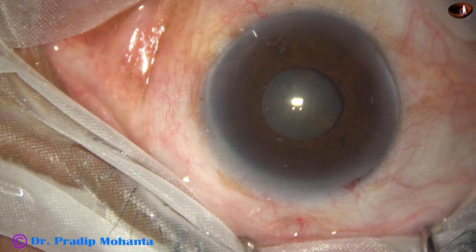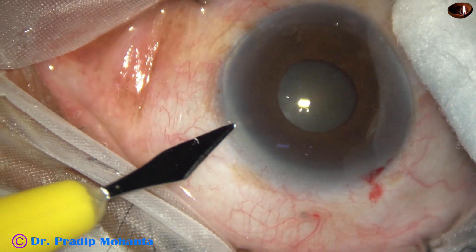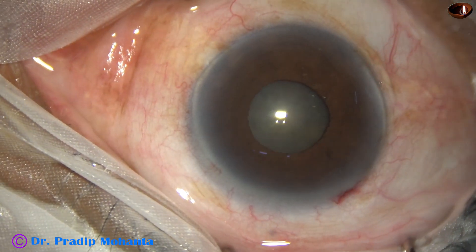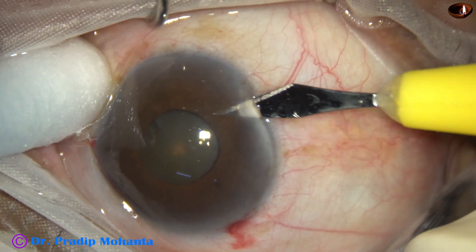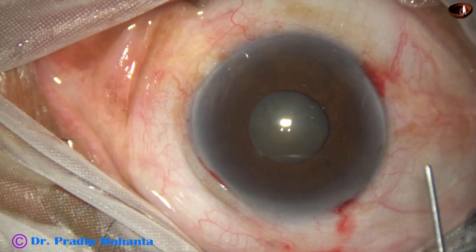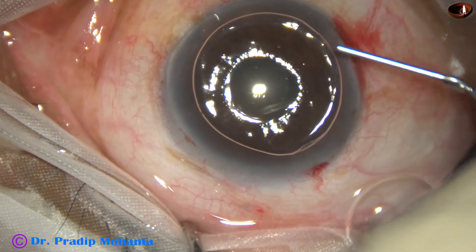Let us observe the management of this case. The 2.8 millimeter incision is on the posterior aspect of the limbus. This is a side port and this is another side port. The side ports are about 2 and a half to 3 clock hours away from the main incision. Now an air bubble is injected into the anterior chamber.